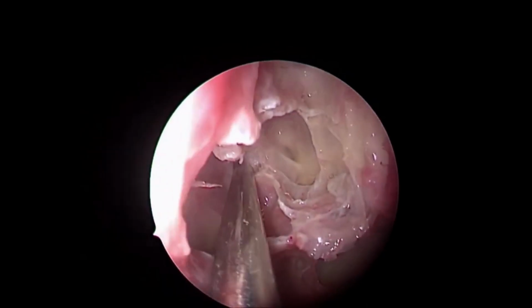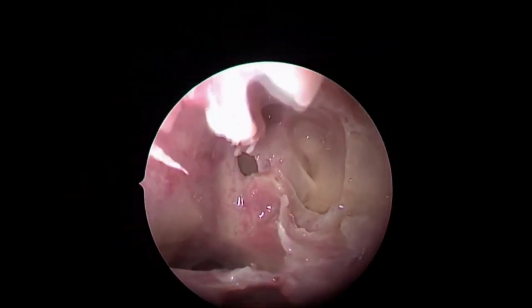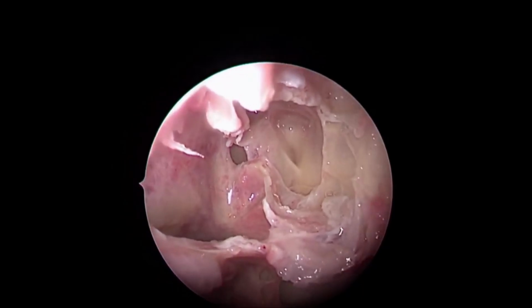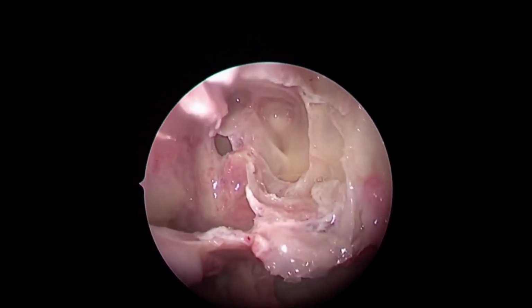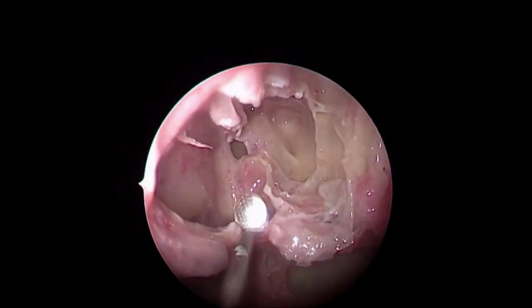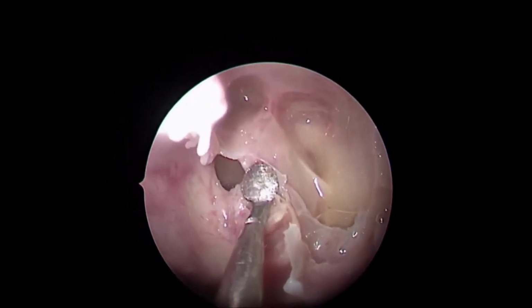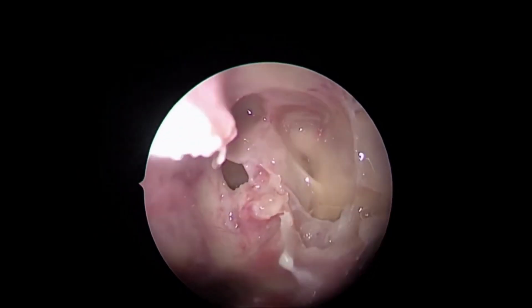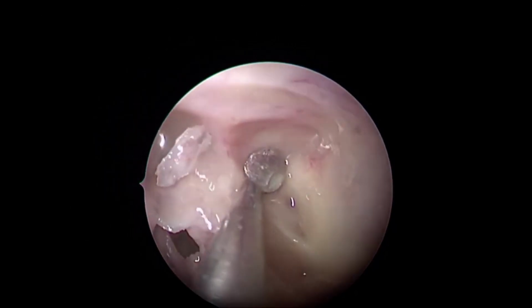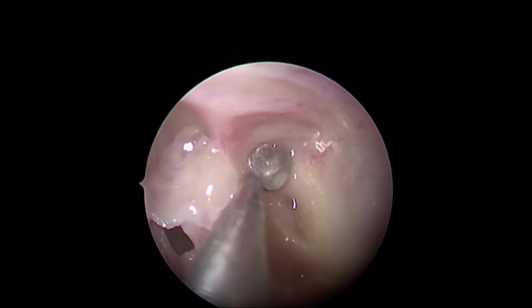So now, why I was saying this is a life-saving moment for all sinus surgeons. Believe me, take this sphenoid sinus as a landmark. See what can happen. I was doing this post-ethmoidectomy. If I don't consider this as my posterior limit, and I am carried away posteriorly, see this? What is there? This is the optic nerve.